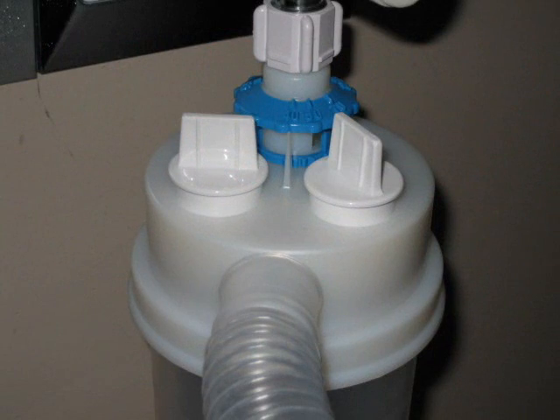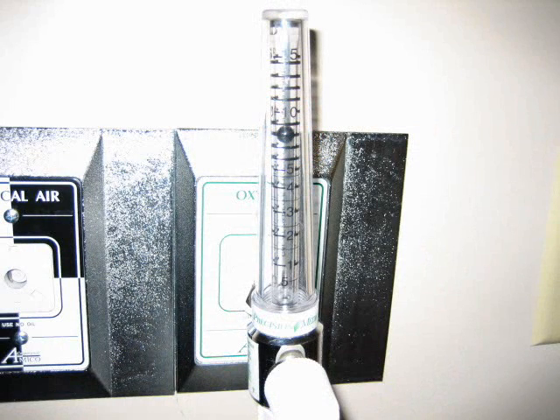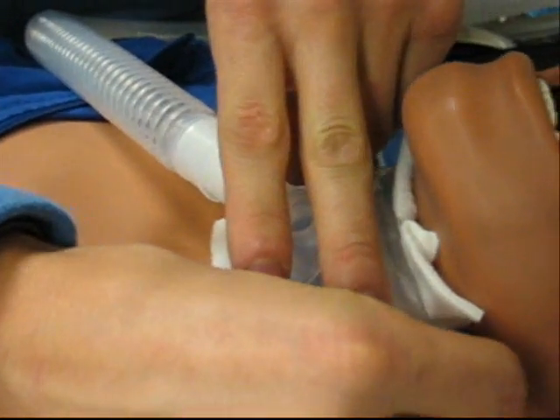The large volume nebulizer should be attached to the appropriate flow meter, and the flow set to ensure an adequate total output flow that meets or exceeds the patient's peak inspiratory flow needs. It is at this point that the implementation of therapy may begin.